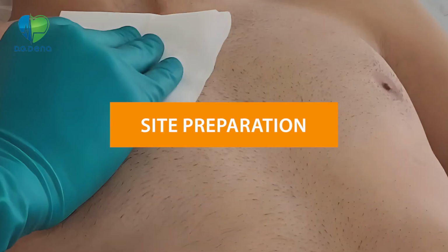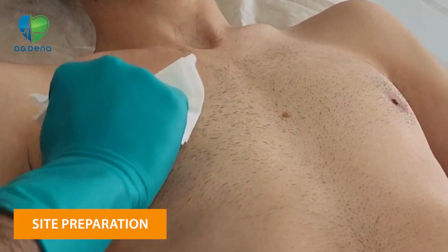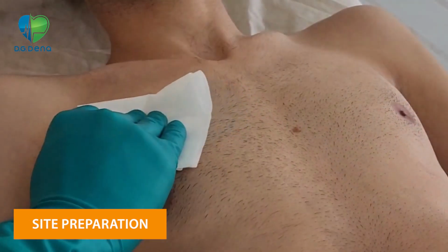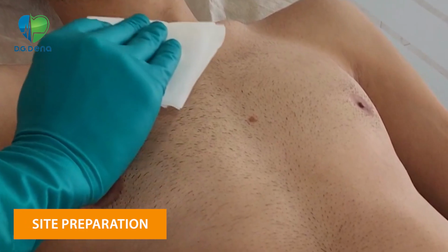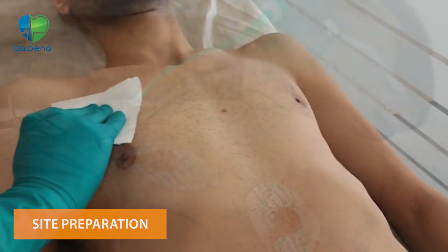Site preparation. Always ensure that the skin is completely dry before placing the electrode. Also, whenever possible, avoid using alcohol for skin preparation, as it can dry out the skin, increase skin impedance, and cause interference with the heart's electrical signals. If alcohol does not fully dry, it may also lead to skin irritation.